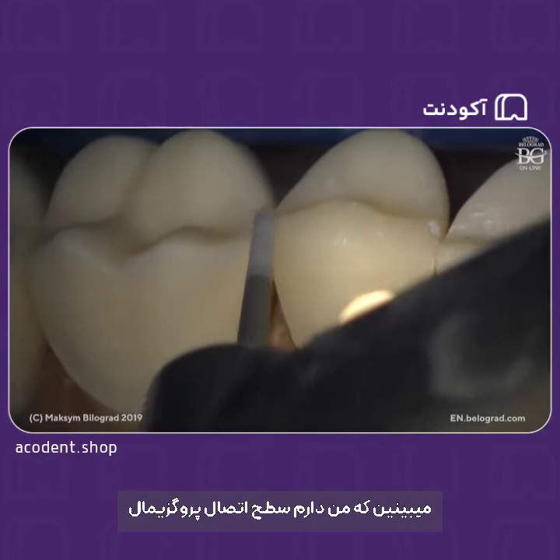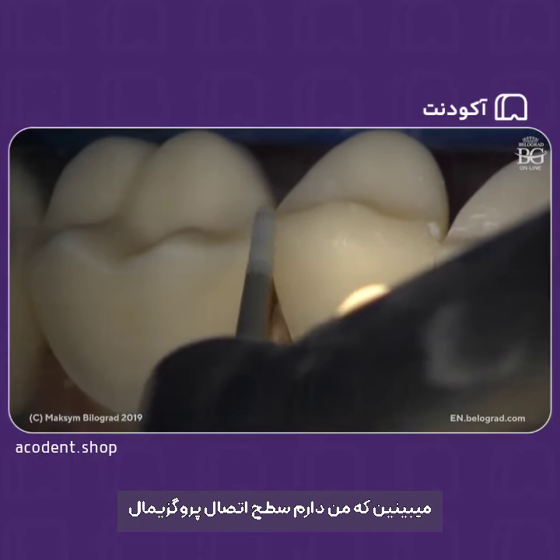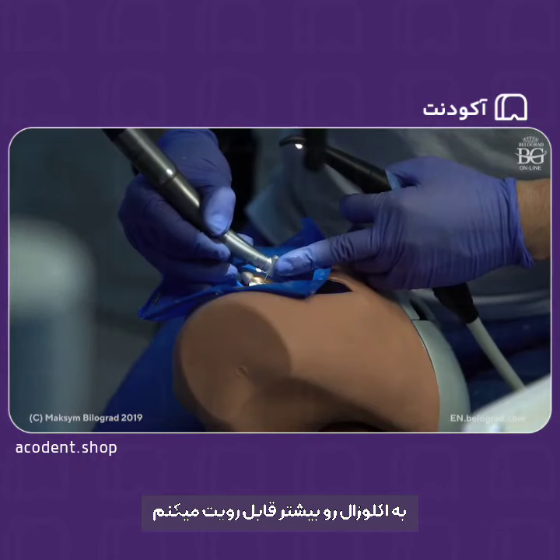I see that I'm also making a really visible transition from proximal to occlusal.